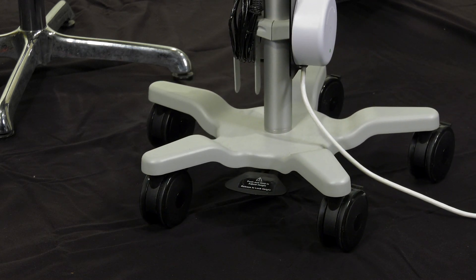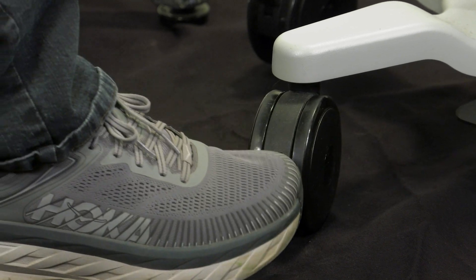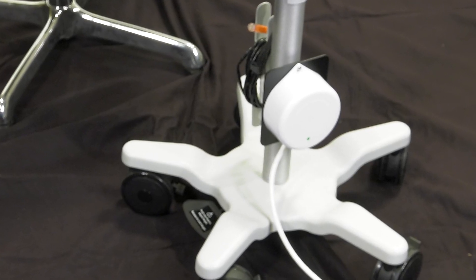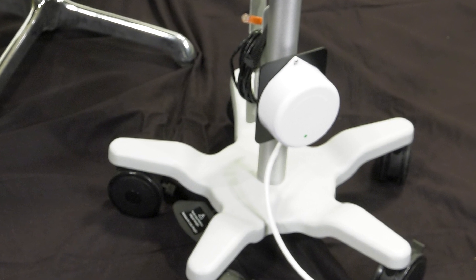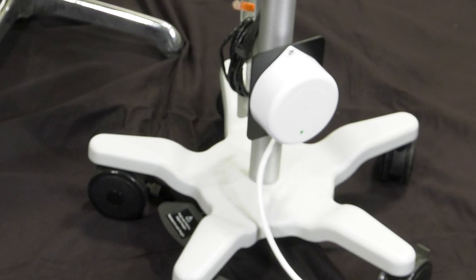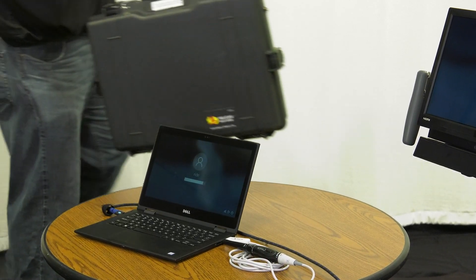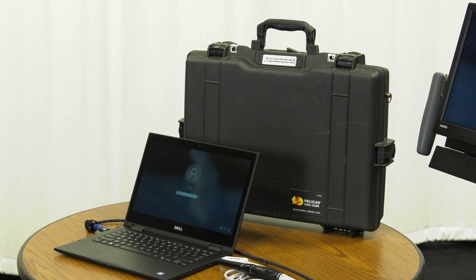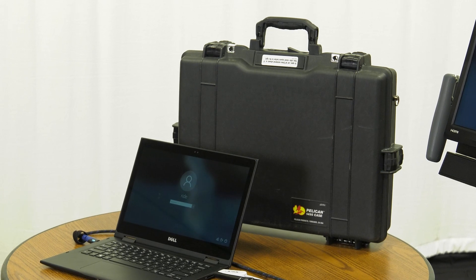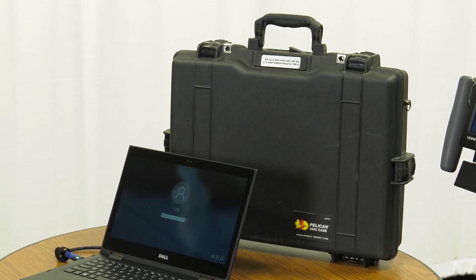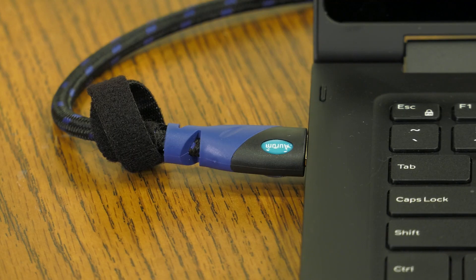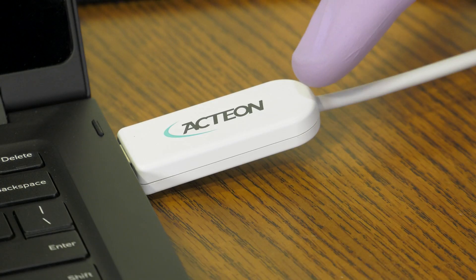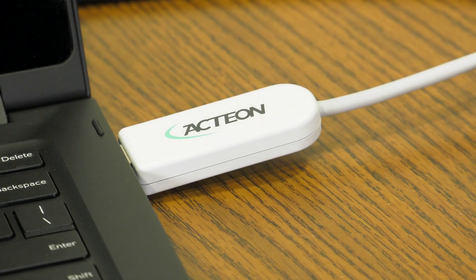The wheels have built-in locks which can keep the cart in place while in use. There is a cable wrap near the bottom of the cart. The power cord is also located at the base. Each cart is shipped with a Pelican carrying case containing a Dell Latitude 3390 laptop and Acteon Soprolife intraoral camera. The laptop connects to the unit separately through an HDMI cable. The intraoral camera connects to the laptop.